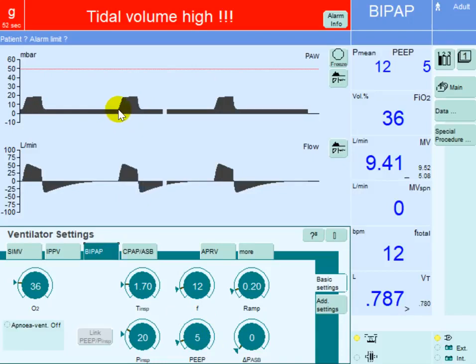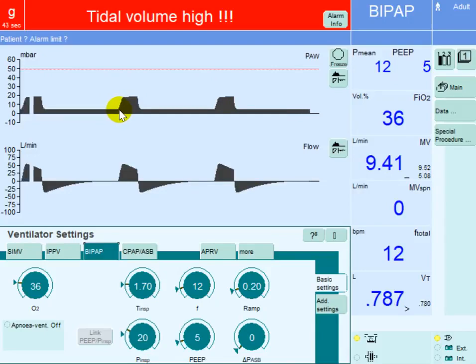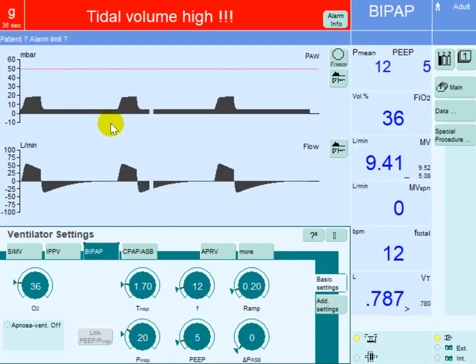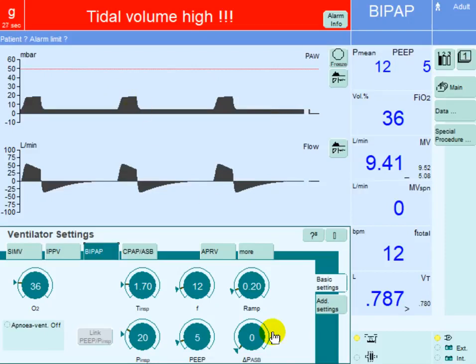When the breath is initiated, the pressure will go up from the PEEP level of 5 all the way to the inspiratory pressure of 20. The time required to go from this point to this point is set by the ramp. Here it takes 0.2 seconds to go from the PEEP level of 5 up to the inspiratory pressure of 20.